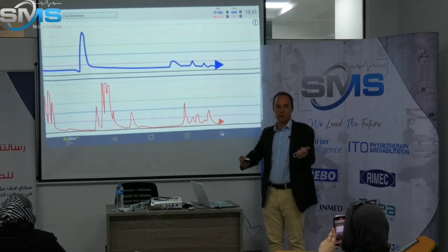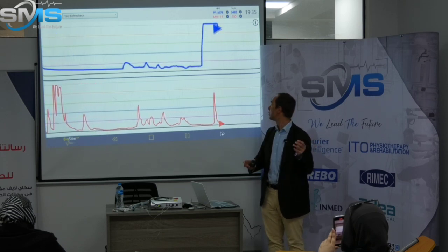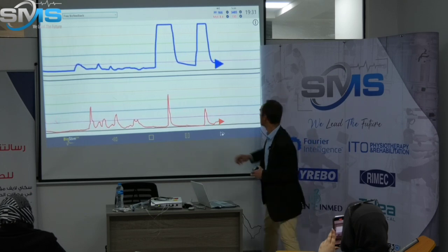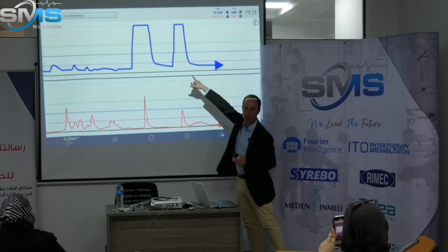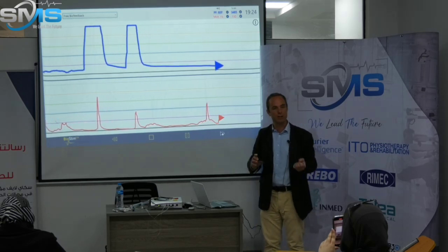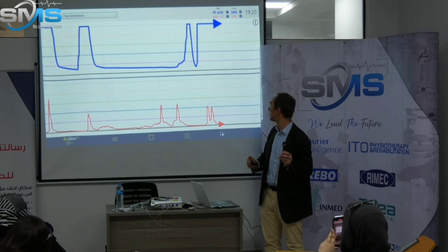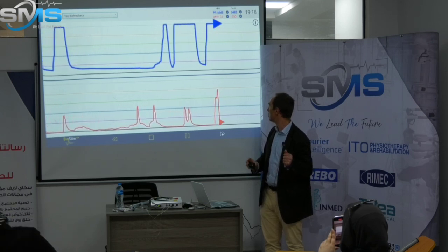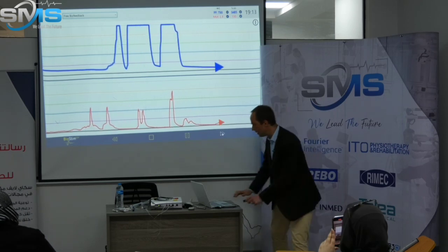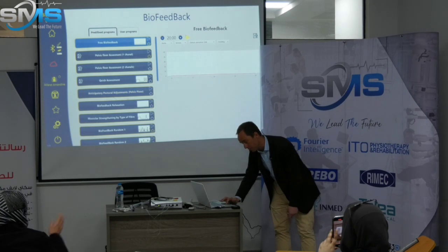It's very easy to do. You just have to tell your patient to contract, move, relax. Contract, move, relax. And here you can see that before the movement you have a contraction. Of course, because she's doing it willingly, but by repeating this kind of contract, move, relax, after some time it will become a reflex. And then you can work with your patient on a very specific and difficult exercise.